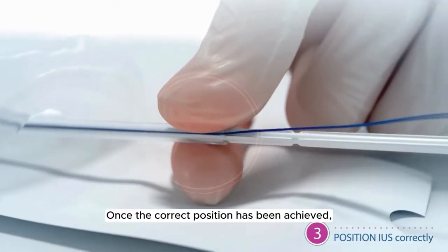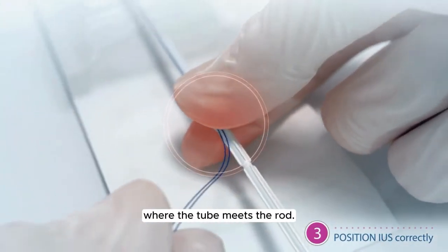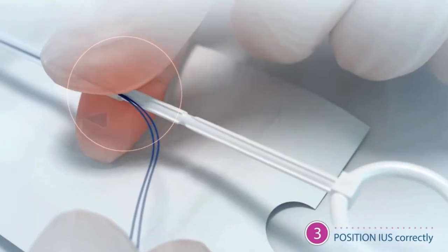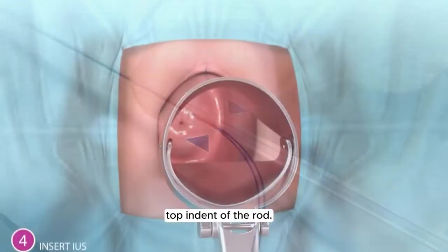Once the correct position has been achieved, pinch and hold the lower end of the tube where the tube meets the rod. Note, the top of the rod should be touching the bottom of the IUS. The lower end of the tube should align with the first top indent of the rod.